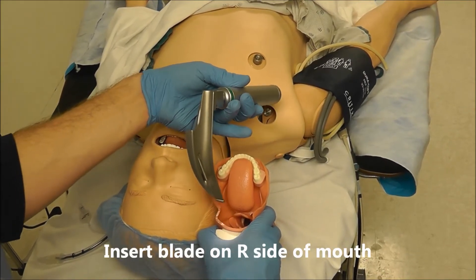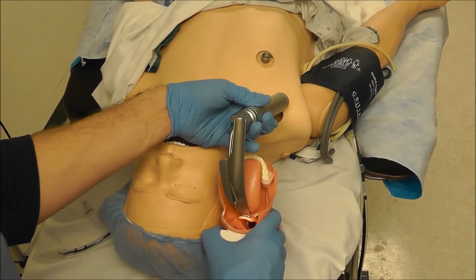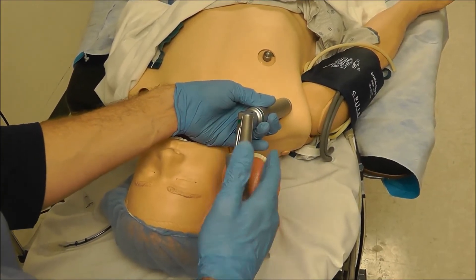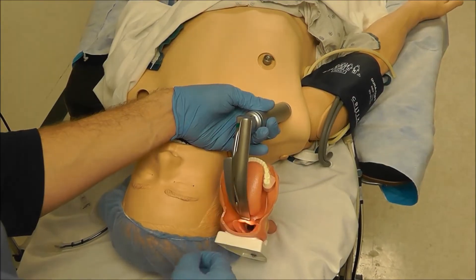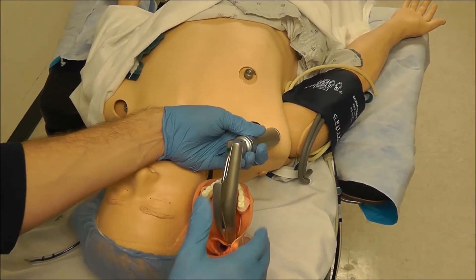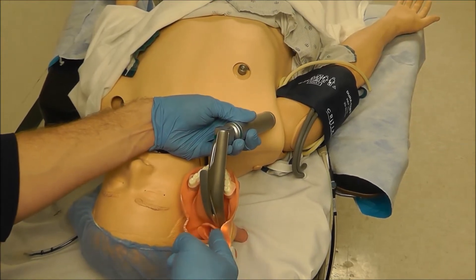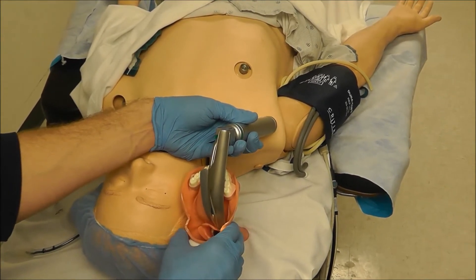Because in a non-plastic tongue — in a real patient — if you insert the blade in the middle, the tongue can have a tendency to flop down on the right or the left. So when we insert the blade on the right side of the mouth, it ensures that the tongue flops down on the left side of the blade, creating a clear passage for our view and for our endotracheal tube.